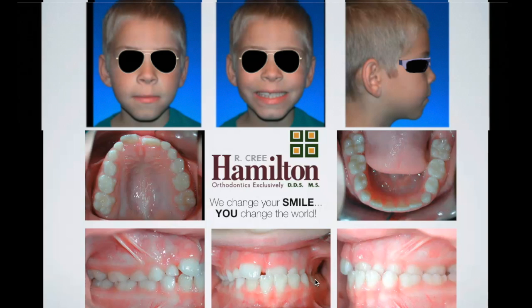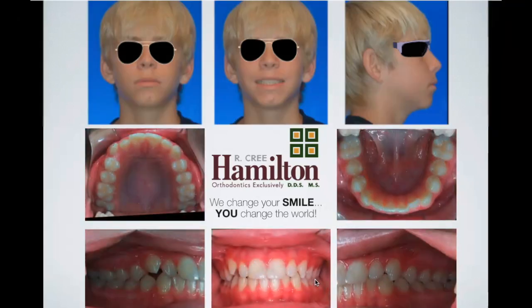And if anything, he's got sort of an anterior crossbite tendency, which means he has more of what type of dental malocclusion? Yeah, he's more Class 3, right? So that lower jaw, we're worried about that coming forward too much. So the further we get that upper jaw out in front of things, the more likely we are to have a good result. So we did an upper expander, followed up by, at the time, a Hawley with finger springs, which I would not suggest learning. That's an art that you never need to know, and you won't miss out on anything.